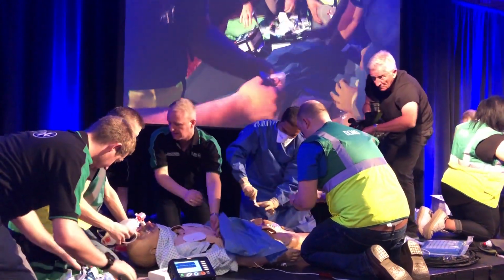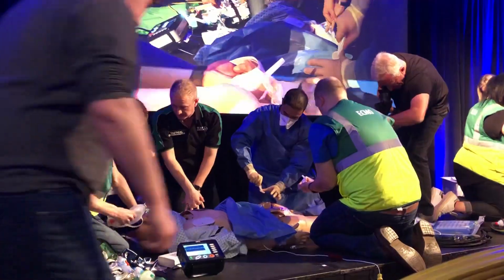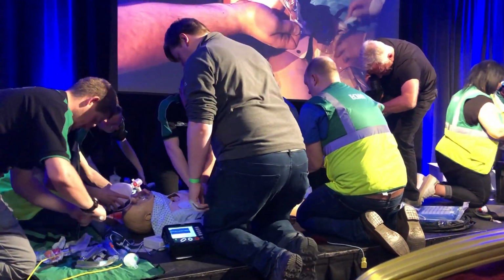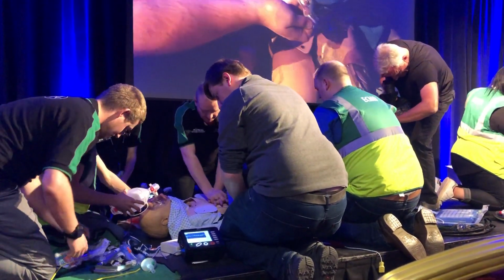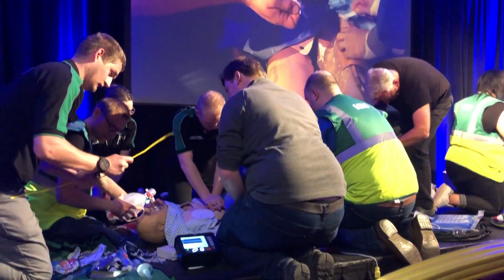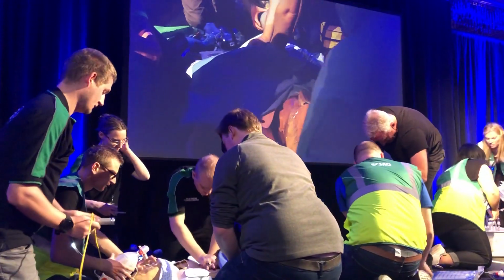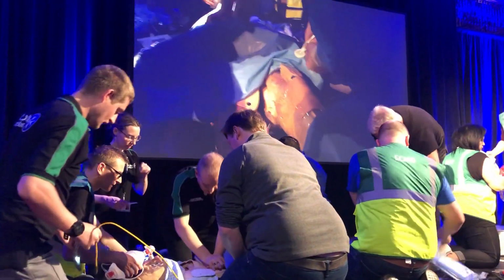and sterilise, getting out of the car to save time, and then the facilitator will help them prepare the groin area for cannulation. And you may say, well, hang on, we're only 5 minutes into cardiac arrest. I don't want to go onto ECMO at 5 minutes, so I'd like to try and get a ROSC, please. And you'd be quite right.